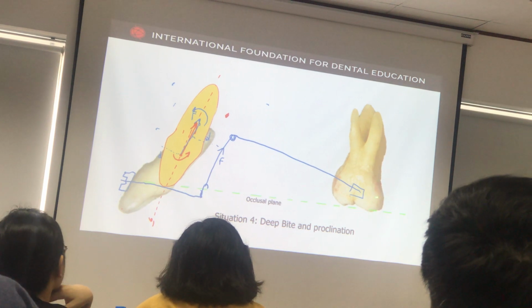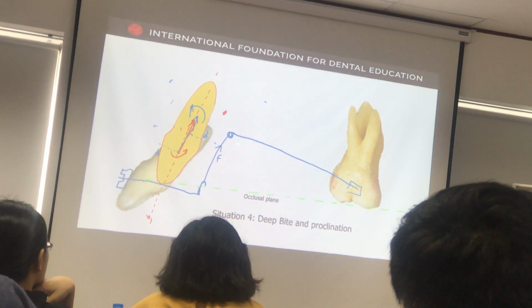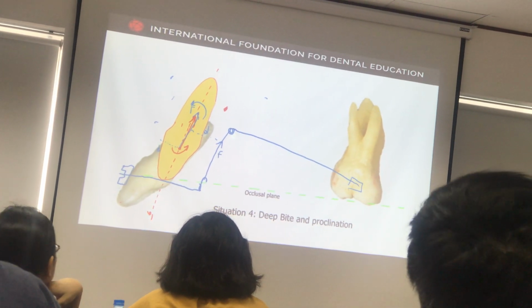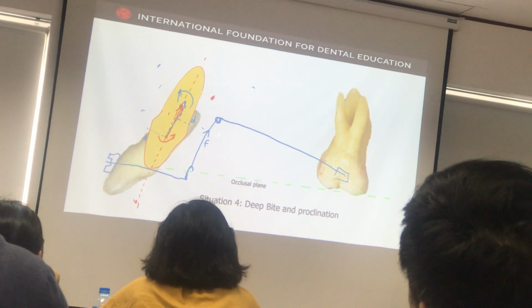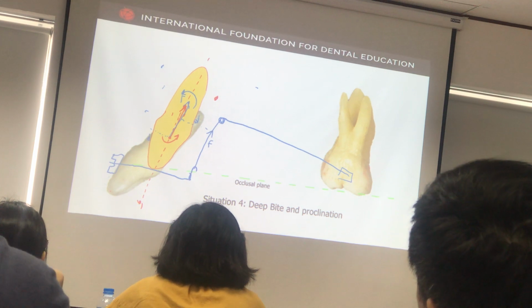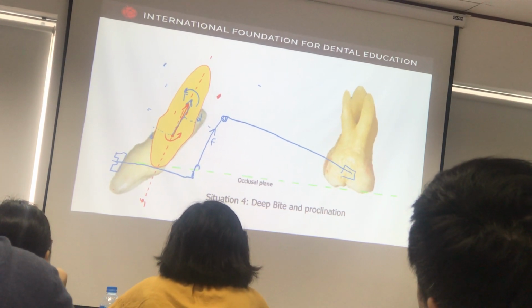Thế còn ở phía đằng này thì là chúng ta thấy là ở phía ống với con 6 chúng ta sẽ có một cái dây phân đoạn. Cái dây này nó sẽ là một cái lực đánh lún, và khi chúng ta nối hai cái đầu này vào thì nó sẽ tạo ra một cái lực ép. Và nhắc đi nhắc lại là cái này nó không phải là cái dây thẳng, nên là dây phân đoạn.